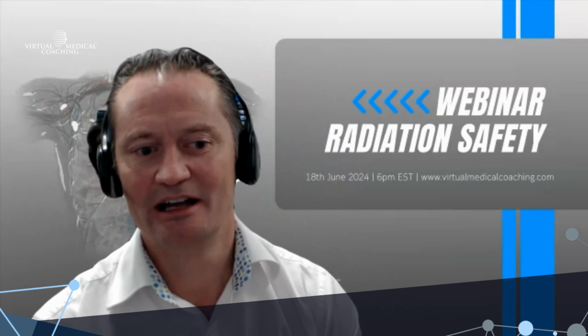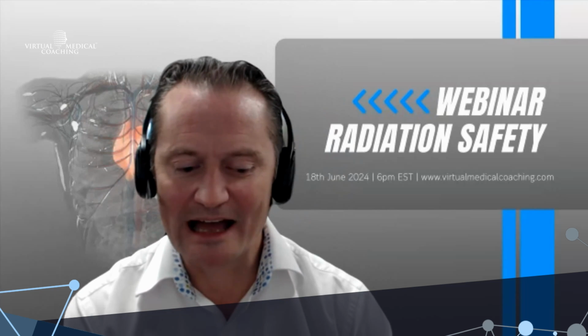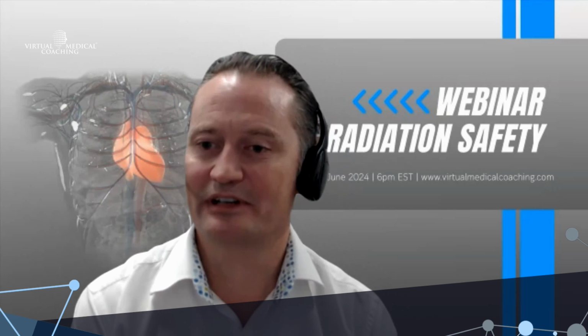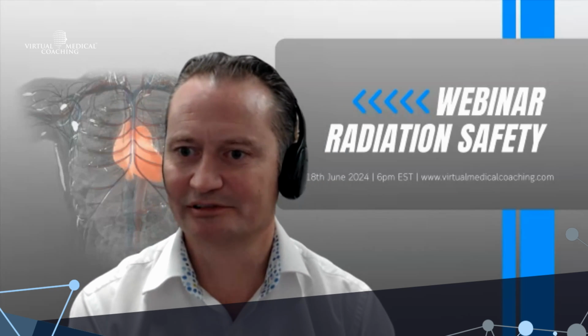She was very impressed, and I turned the radiation on for her. My mum's not medical, and she said, oh my goodness, I can see where I can't be, because if you follow the basic traffic light rules, red is sort of stop, don't go there.